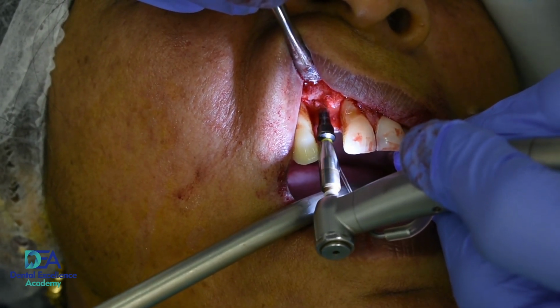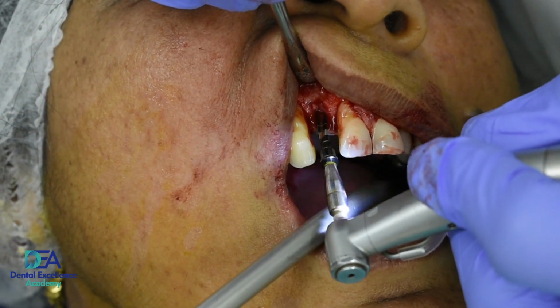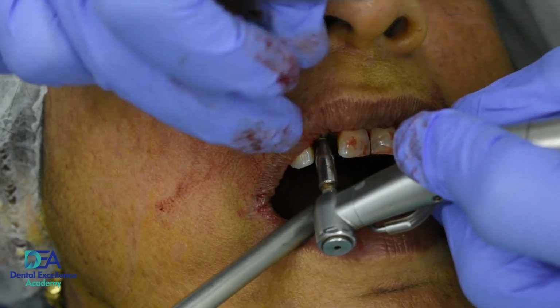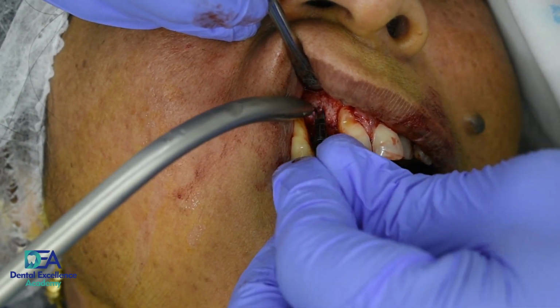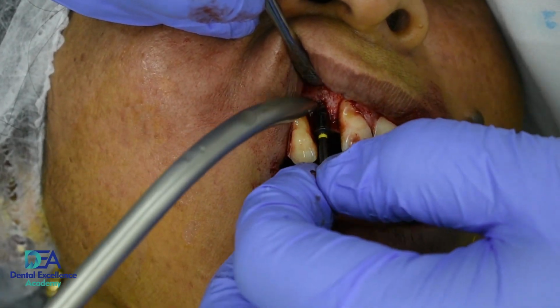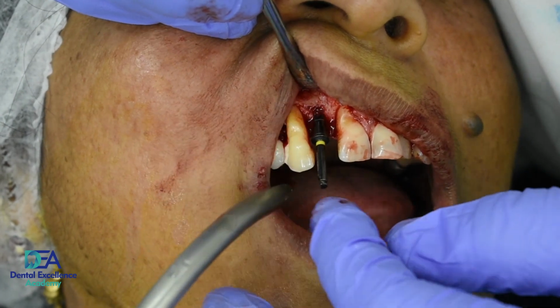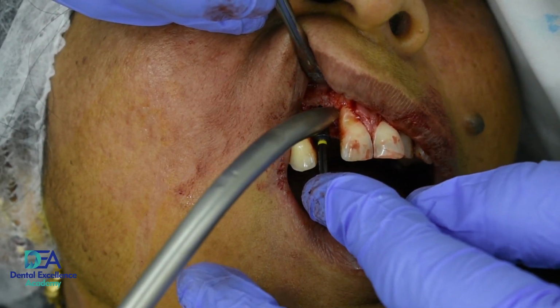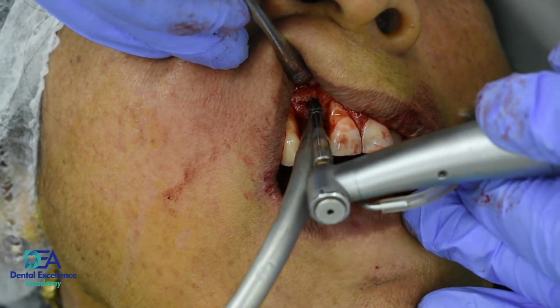So here the buccal bone is less, and now we have to go and check with the x-ray whether we are going properly in a parallel direction to both the teeth. So now you can see we are almost parallel, despite the improper direction of the x-ray.